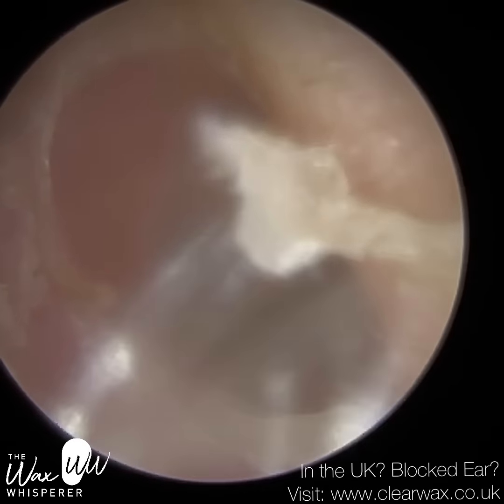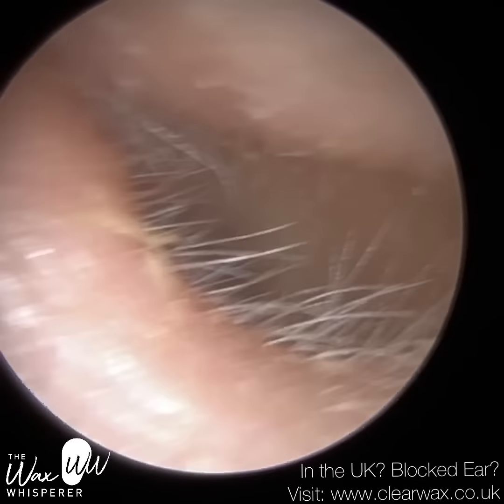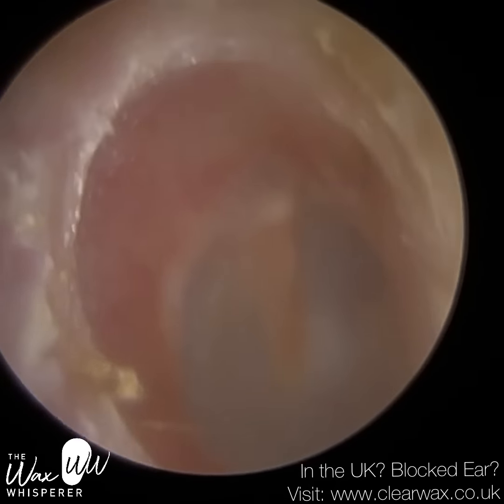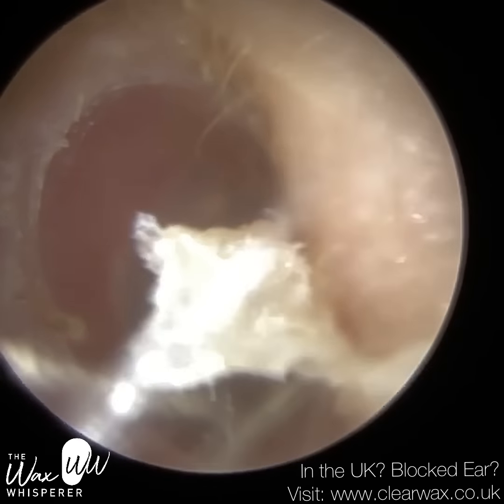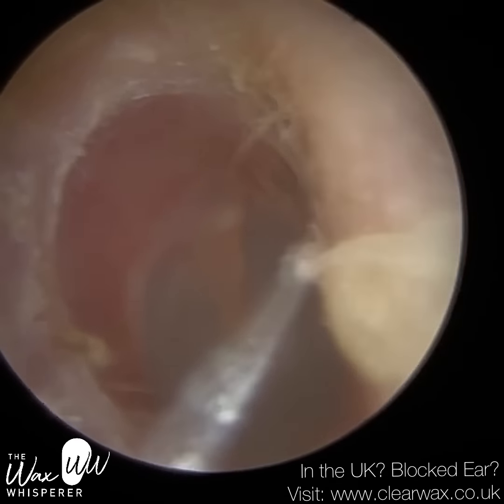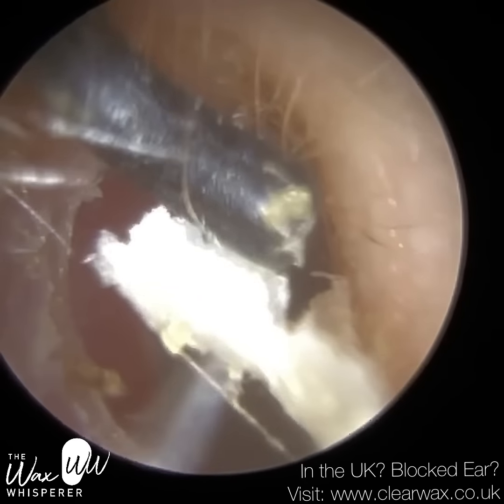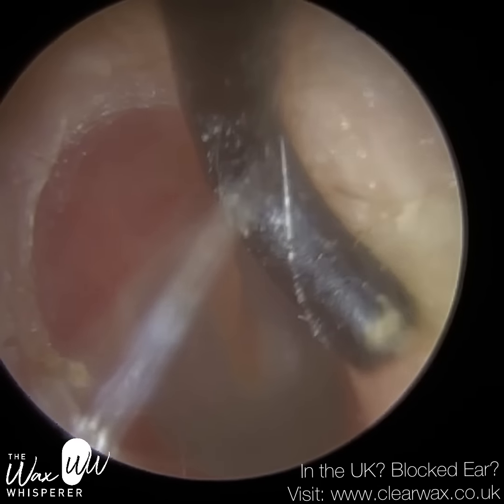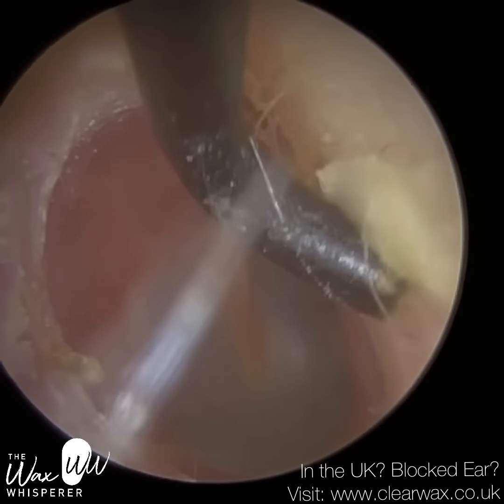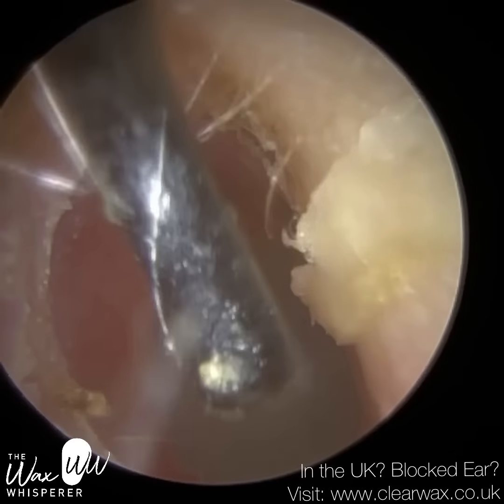Again, the eardrum's intact. There's a light reflex missing. Typically, if you've got a healthy eardrum, when you examine the ear, the light source reflects off the eardrum, typically anteriorly and inferiorly. So in the case of the right ear, in the southeast region, you get a reflection back. We call that the light reflex, and it normally suggests a healthy eardrum, not always.